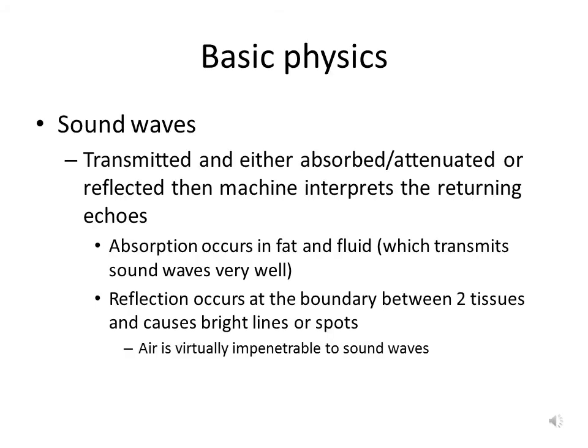So ultrasound basically consists of the machine and then the probe. The probe contains crystals set in a line along its lengthwise axis. And those crystals, when doing ultrasound, have electricity applied to them.